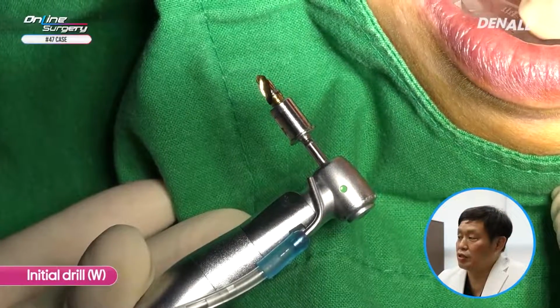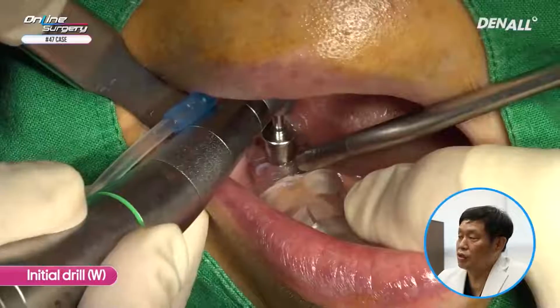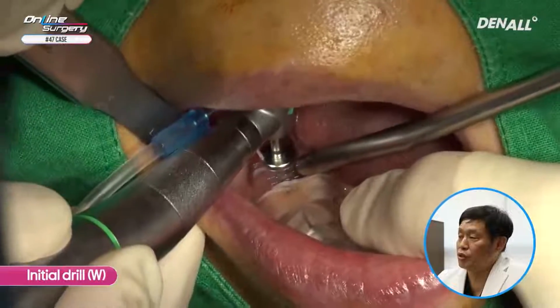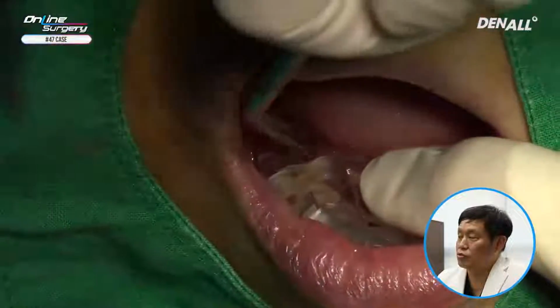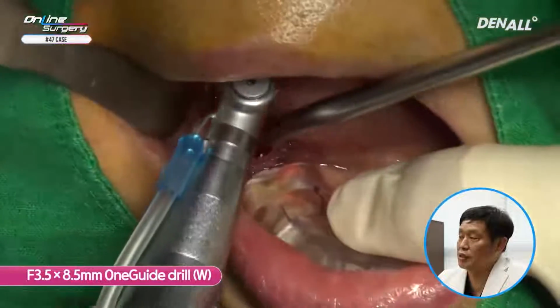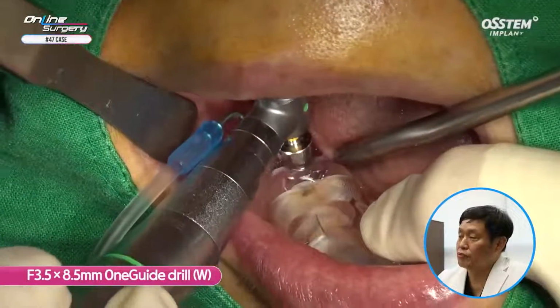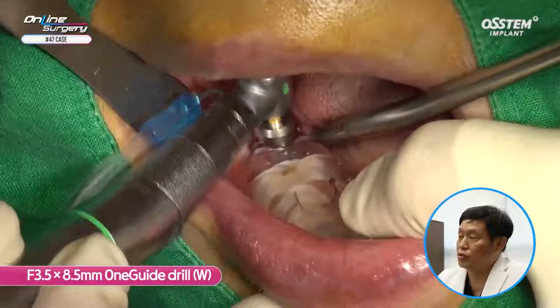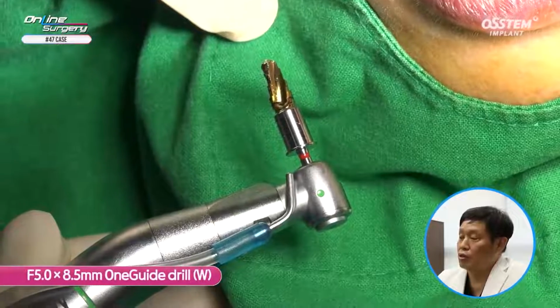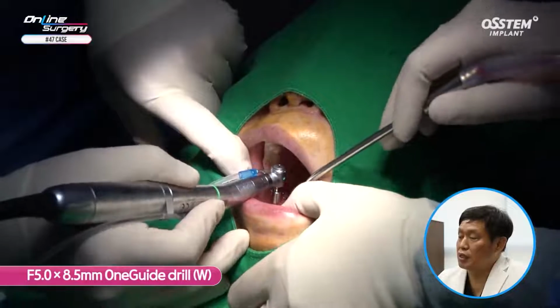The initial drill is used to make the initial hole. You can see that I'm going in full length. Through pumping action, I am preventing any heat from being generated. A 3.5 by 8.5 one guide drill is used to form the hole. This is being done without a problem. Pumping action is used so that saline can go in to prevent heat generation. A 5.0 by 8.5 one guide drill is used to do final drilling.